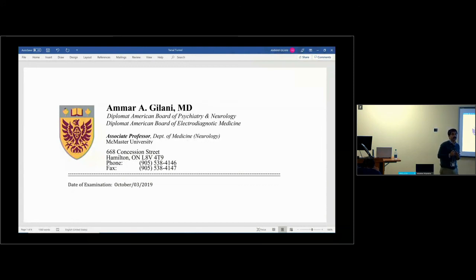Sometimes we do what we call sympathetic skin responses. What you do is put the electrodes on all 4 limbs, and then you give them either a surprise or a stimulus. I find surprise is better. When you're suspecting autonomic neuropathy, then we look at that response.